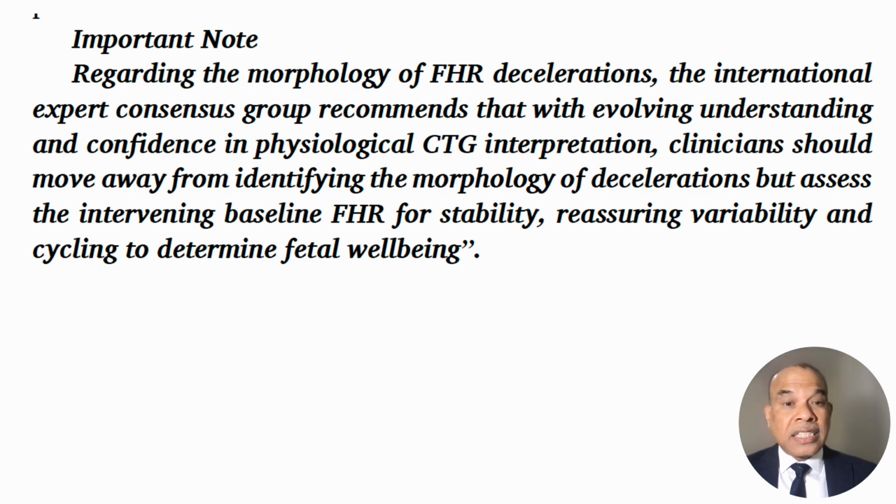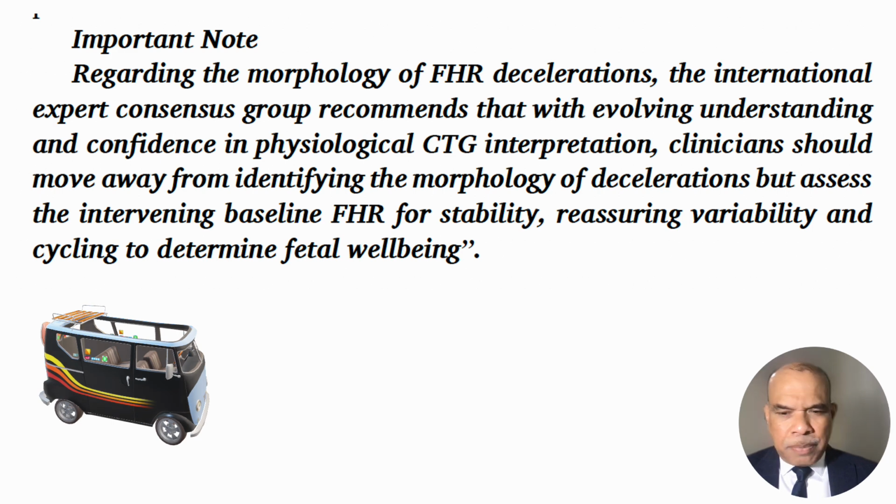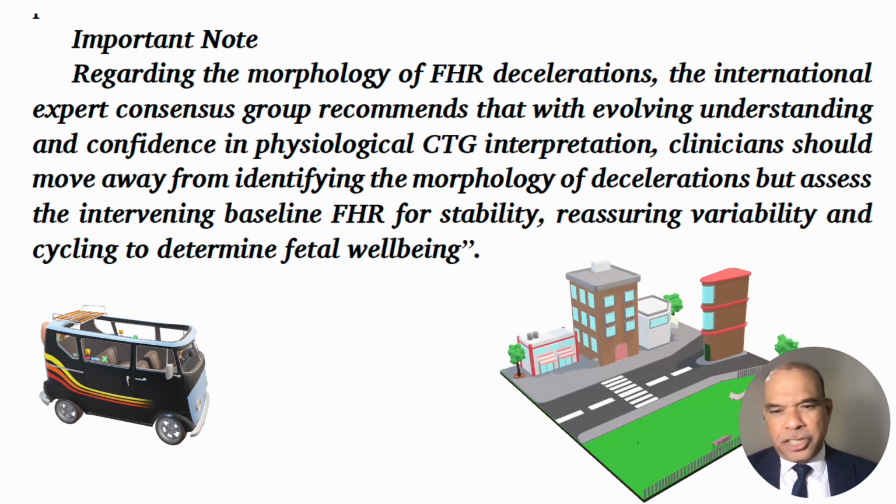So we made a statement in the guideline regarding the morphology of fetal heart rate decelerations. The international expert consensus group recommends that with evolving understanding and confidence in physiological interpretation of CTGs, clinicians should move away from identifying the morphology of the decelerations, but assess the intervening baseline for stability, reassuring variability and cycling to determine fetal well-being. It is because of the simple fact that you have started a journey into physiological interpretation of CTG.